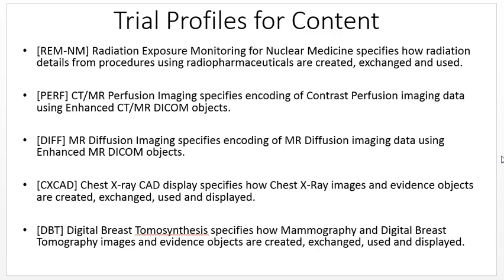Here are the trial profiles for content. They're only in the trial phase, so obviously we don't have the systems involved or the benefits because all that hasn't been worked out yet. I'm sure digital breast tomosynthesis, how many times have I stumbled over that word today, will be up and running soon because it's an emerging modality. So we've completed 2 of the 4 categories.